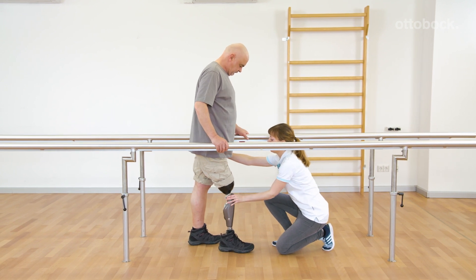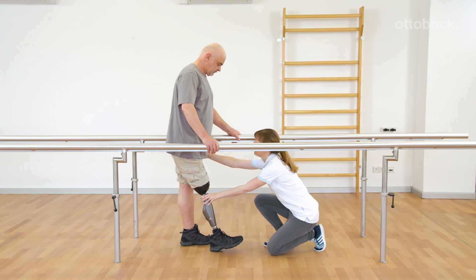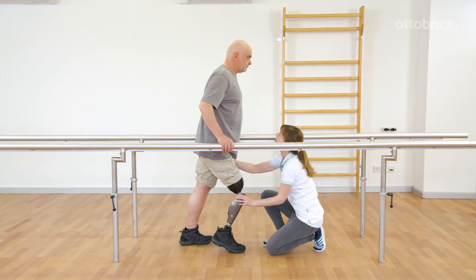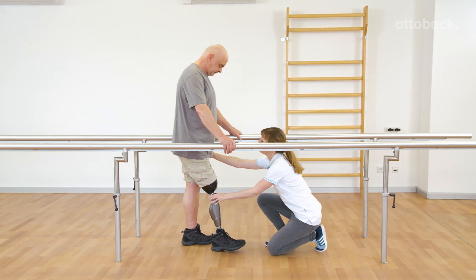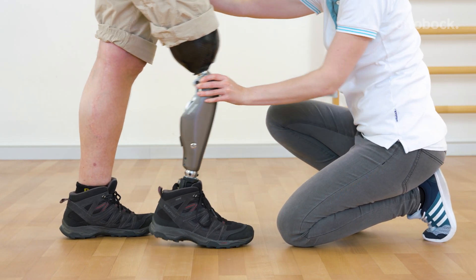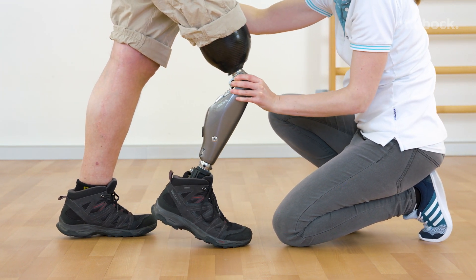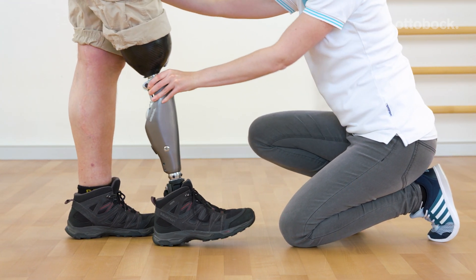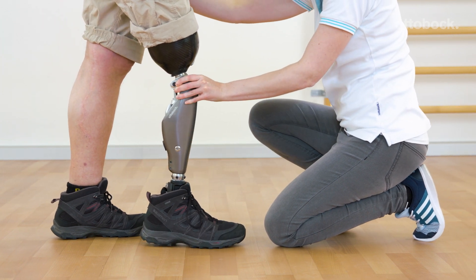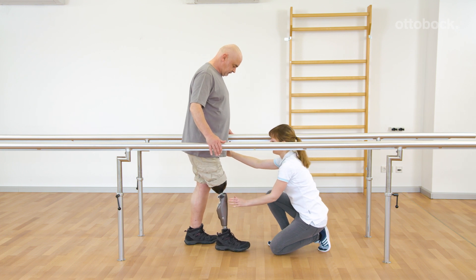Franziska and Gerhard show how to learn and refine the technique called yielding. Gerhard lets the knee joint yield as he applies his weight. He feels the resistance against knee flexion and consciously rolls over the foot. When practicing without holding onto the bars, the amount of yielding into knee flexion is determined by his ability to bring the knee back into extension.